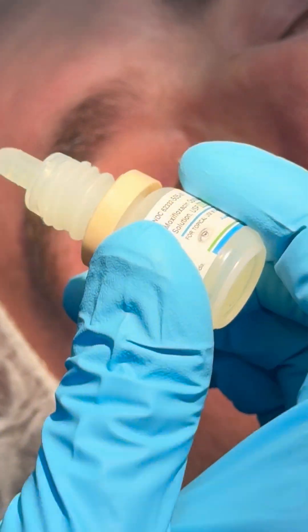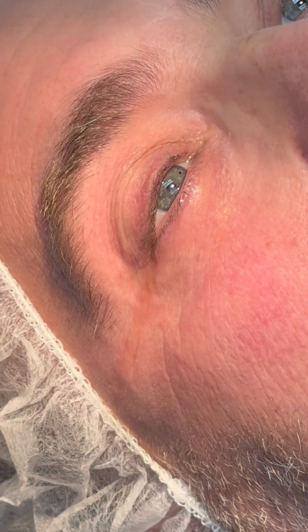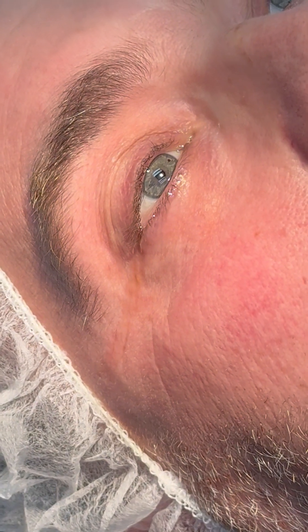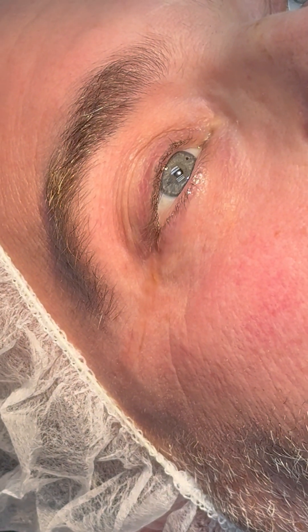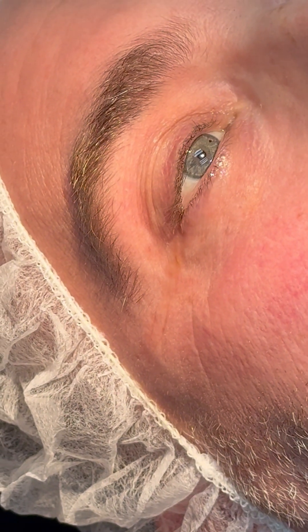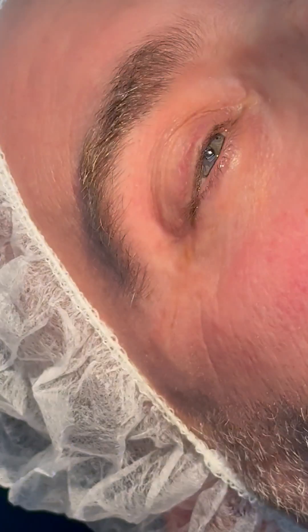So this is a refinement from the original technique that I described. I gave him a little Proparacaine numbing drop, a little antibiotic drop, and a drop of Lumify. The Lumify will constrict the conjunctiva a little bit and make those blood vessels a little bit smaller so we get less bleeding. What I'm trying to do is perform this procedure and not have the patient red or too red afterwards. I find that the Lumify will keep the bleeding down if there's any.